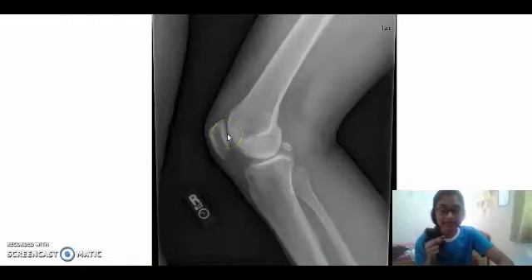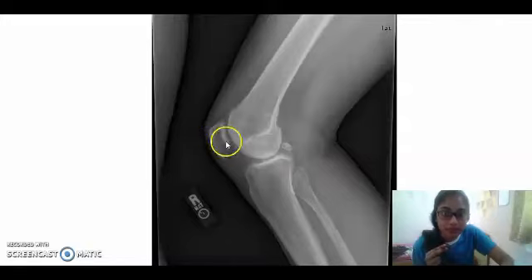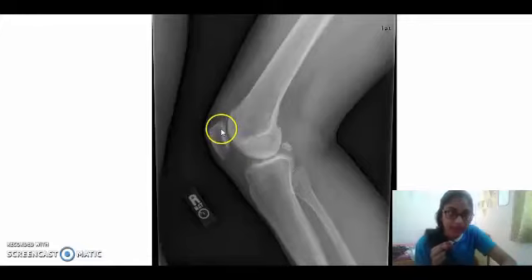This is a lateral knee radiograph. It is in a true lateral without rotation because the posterior borders of the femoral condyles are directly superimposed. The patella is also in profile, with the femoropatellar joint open, and the femorotibial joint is also open. The anatomy demonstrated in this film are the distal femur, proximal tibia and fibula, and also the patella.